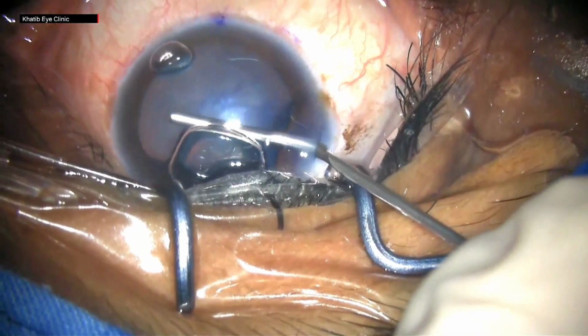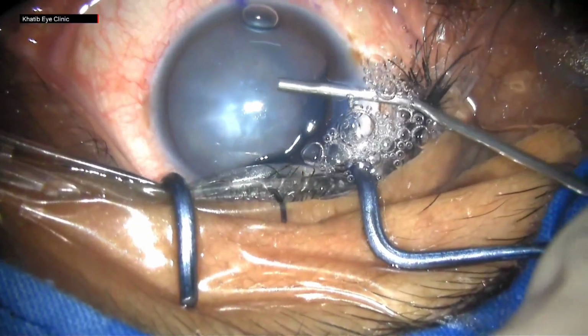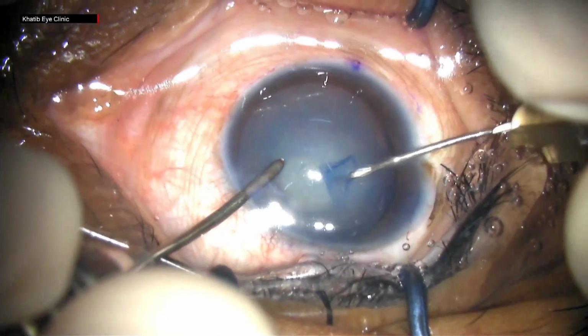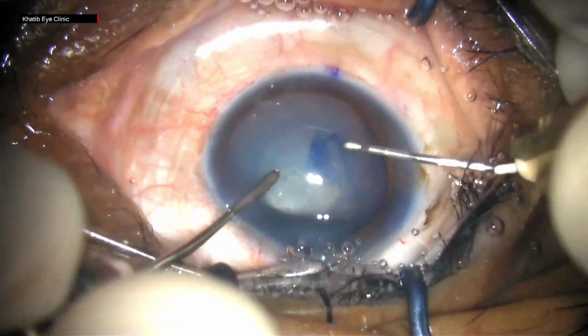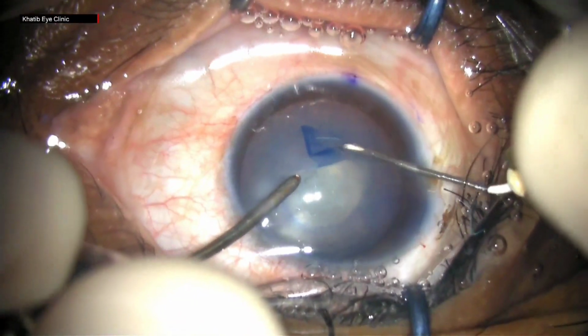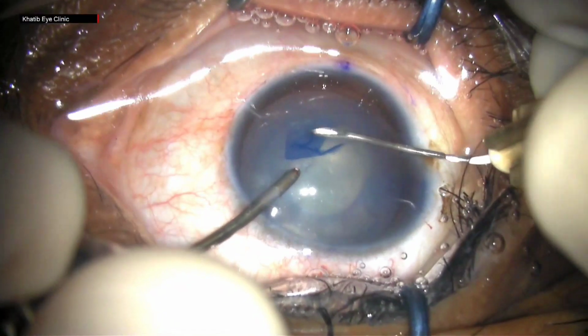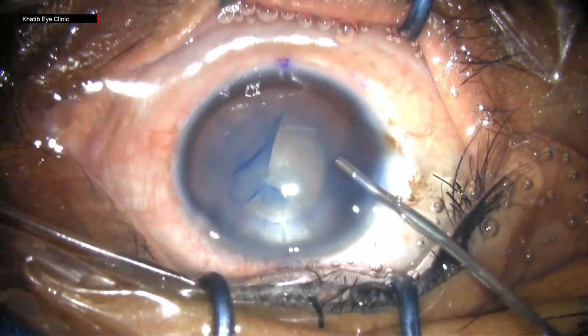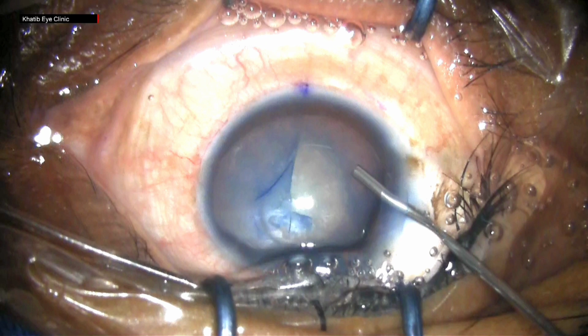So this is a mature cataract with a shallow anterior chamber. We can see that the patient is squeezing the eye. The Rhexis is initiated, but due to constant squeezing of the patient, we see that the Rhexis is starting to change direction and going outwards. I stop here and come out and try to repressurize the chamber. Let us pause and study this scenario.